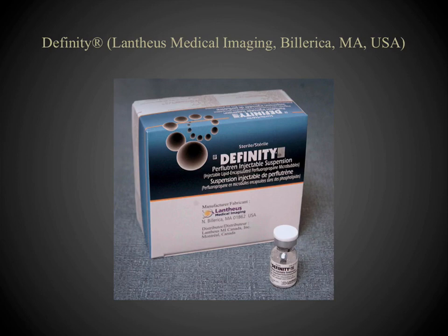In Canada, the approved contrast agent is Definity from Lantheus Medical Imaging in Massachusetts. Although slight differences in volume and preparation may be encountered with different microbubble contrast agents of the same family, fundamental CEUS technique remains the same.